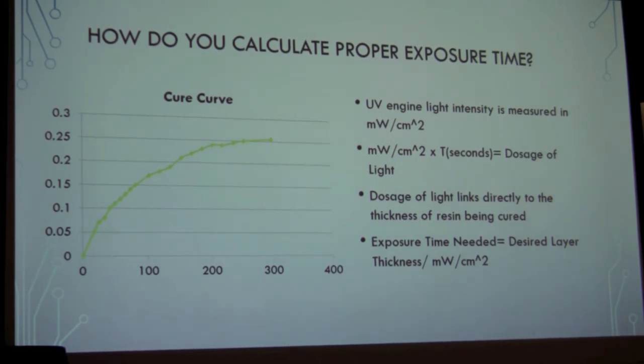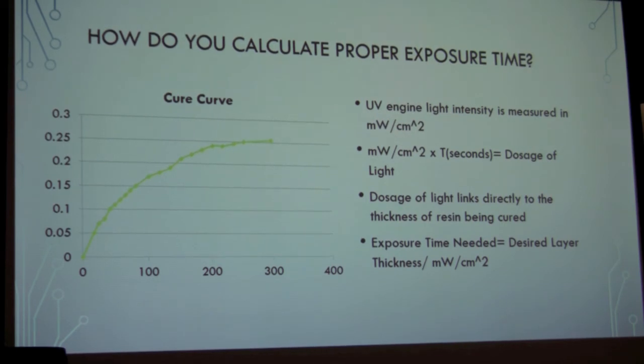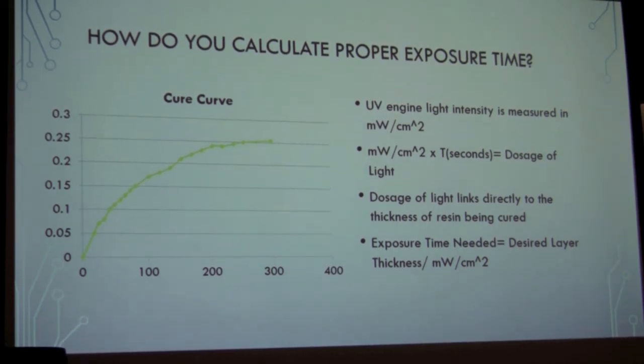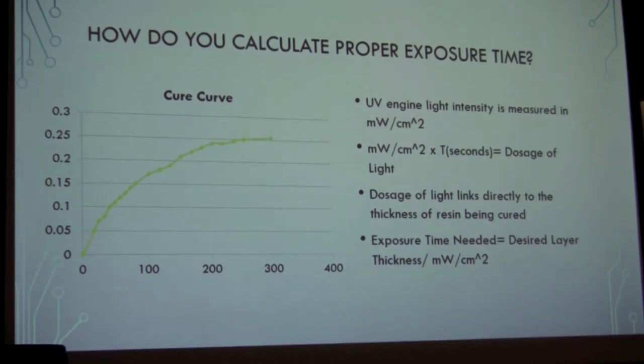Now the next resin that you may have is going to have either a steeper curve or a flatter curve. This is something you see in the background. I almost deleted it just because it's a little more technical.